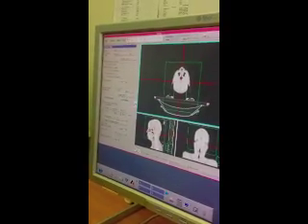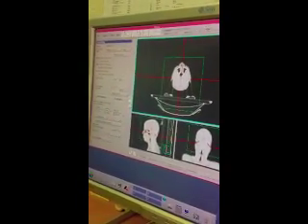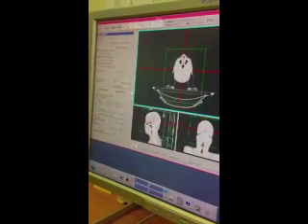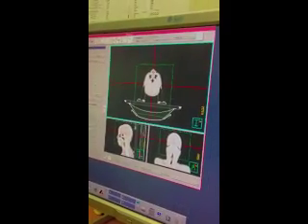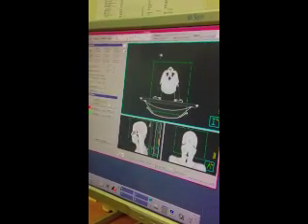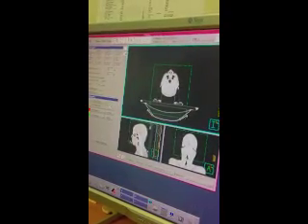Next thing you're going to do is localize the isocenter, which we saw, which was created downstairs in CT simulation. I've already labeled it here CT ISO, and I'm just going to copy from POI so then it'll localize, as you can see right here, to that point. This is a point about which the gantry is going to rotate, and the point at which the therapist will set up downstairs for the radiation treatment to ensure that the correct area is being treated. Once that's done, you'll create your dose grid, which you see right here in green. That is the area in which you're going to calculate. So make sure to include any area that you want to know dose to.